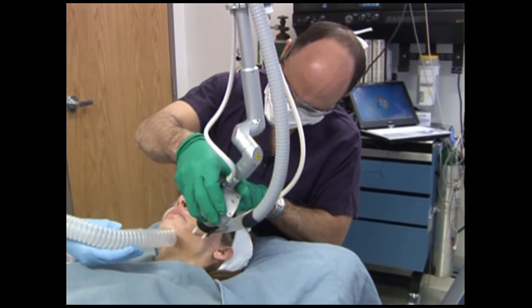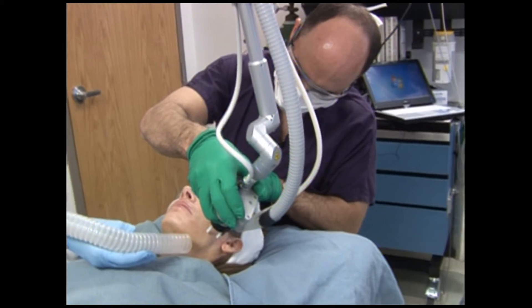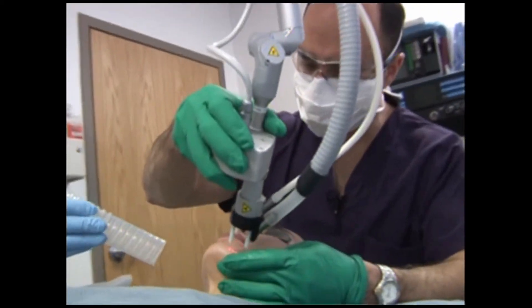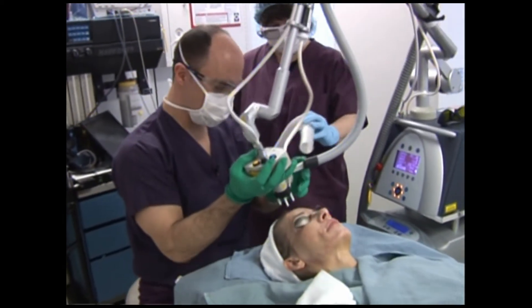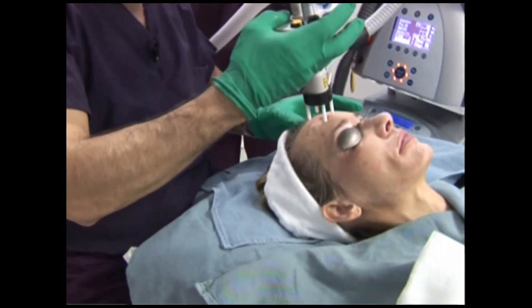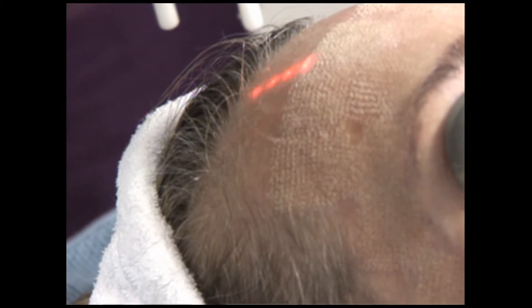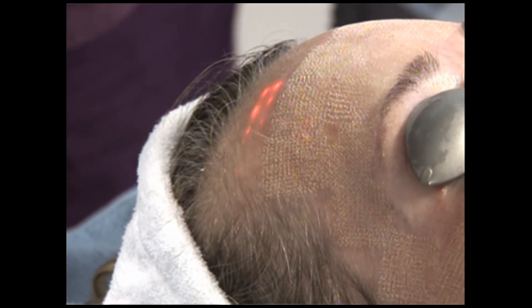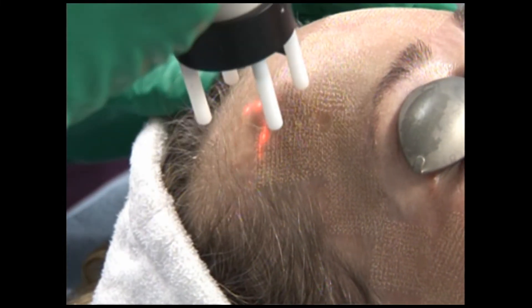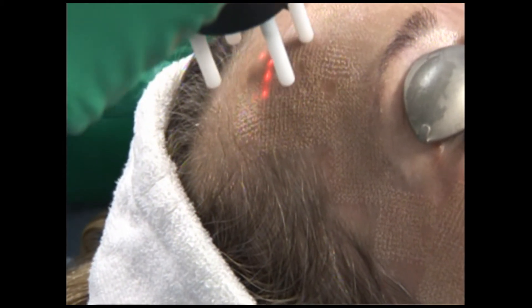The main indication for Christine's laser is melasma, the patchy pigmentation, plus a little bit of acne scarring. If you're getting the procedure more than once, typically six to eight weeks between treatments. What we look for is a resolution of the redness — most patients are red for two to three weeks with trace redness even after that. So you want to see that go away.